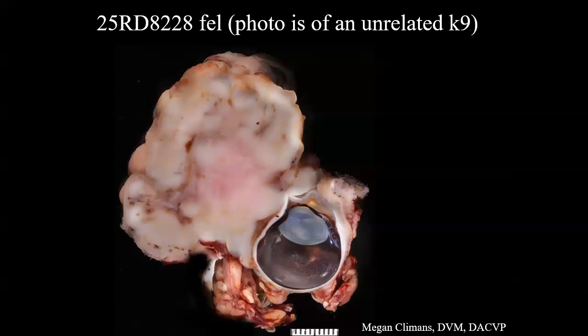So, this first gross image is not our case. It is actually a completely unrelated dog, and our case is a cat. My point in doing that was just that this case did not have a gross photo, and this gross photo was particularly spectacular with this extremely large periocular mass that smushes the globe to one side, and it is a similar, although not the same diagnosis. This dog also had some asteroid hyalosis, which is kind of cool.